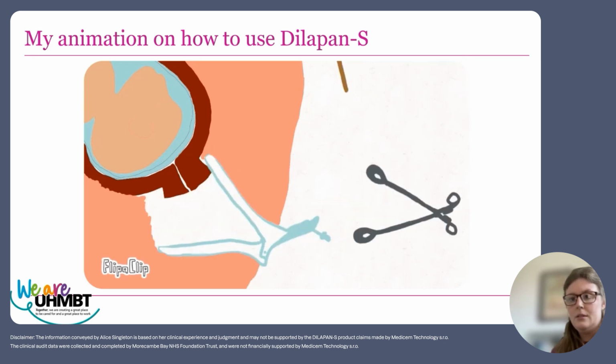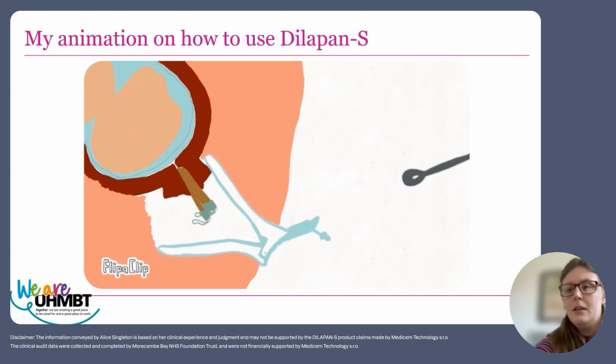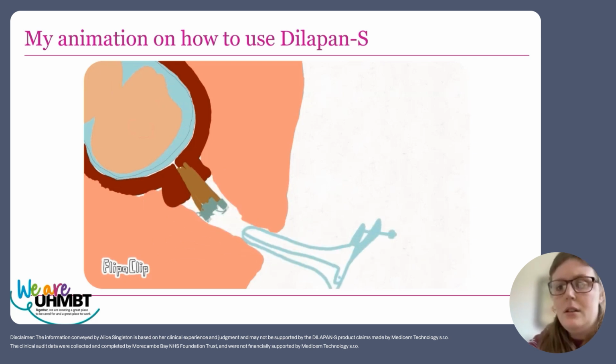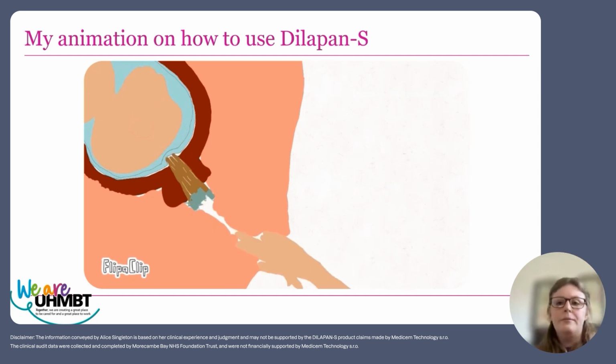You would sight the speculum as normal. You would then insert them in turn into the cervix until you've got 4 to 5 Dilapan into the cervix. At this point, you would then remove your speculum very carefully, ensuring not to trap the strings and accidentally pull the Dilapan out. Then going digitally and push the Dilapan up to make sure that they were through the internal os.